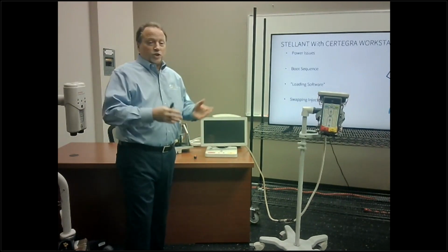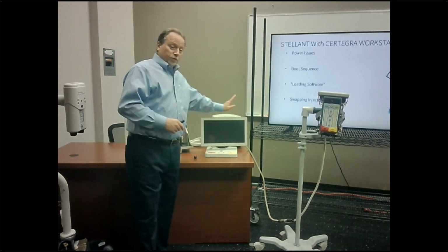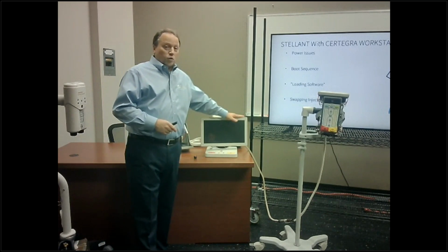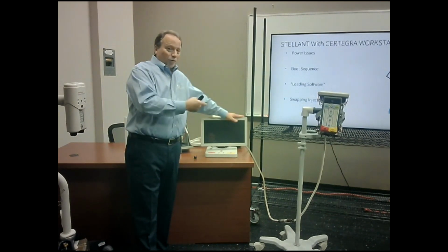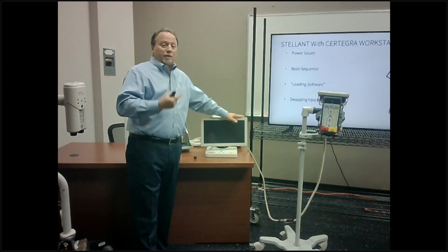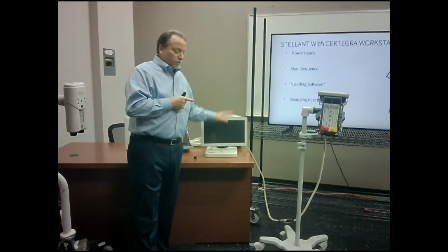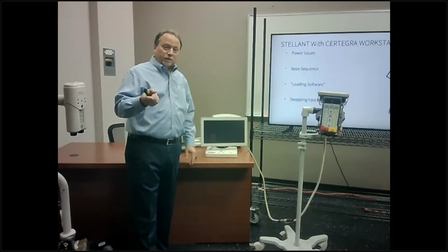They didn't know the injector was off, they just thought the whole injector was down. Well, the display works off its own power supply, and if it loses power and power is reapplied, it'll automatically boot up. But the injector won't. These two systems act independently.